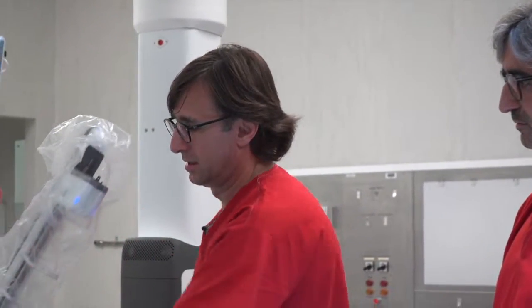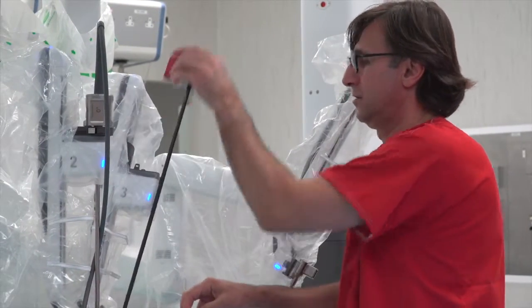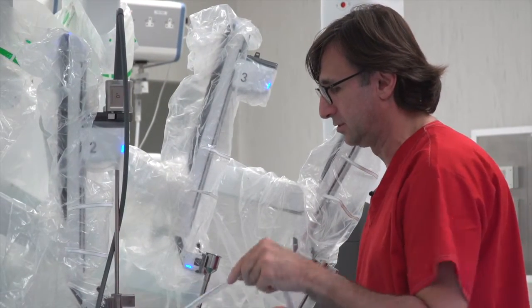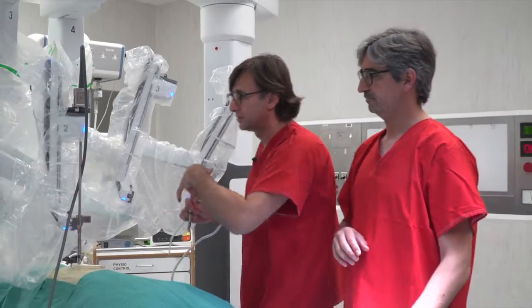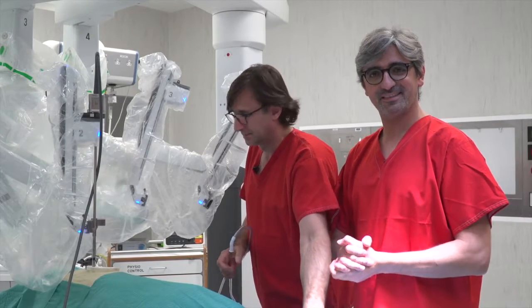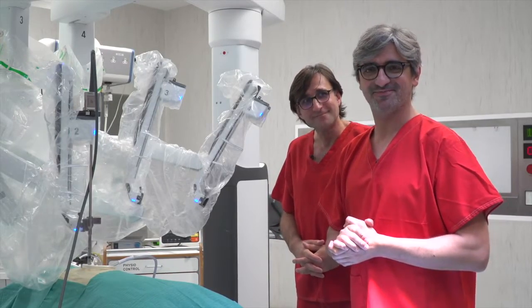This is how we set up the robot, how we put the arms. It's a very quick docking — one to two minutes. And undocking is also very fast. For example, if you want to undock: you take this one out, put this one aside, this one out, this one out — and you are undocked, ready to take action if you have a problem inside. Fast. Changing the ports, moving the robot — it's easy. This is how we set up the ports, how we do uniportal RATS. Let's see with the patient — a more interesting video. Thank you.